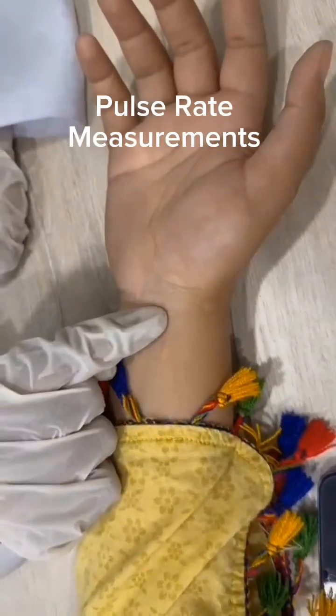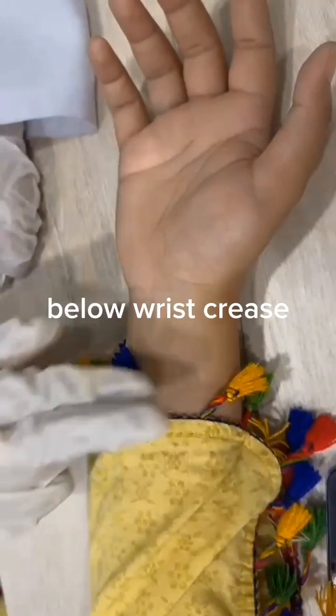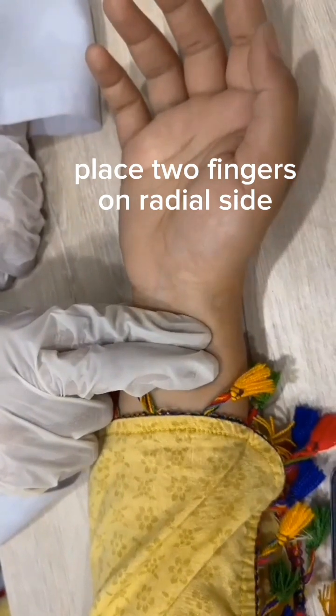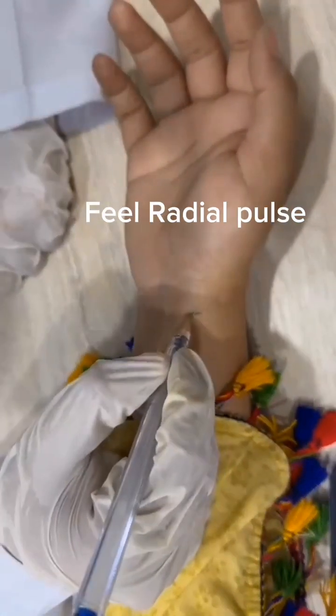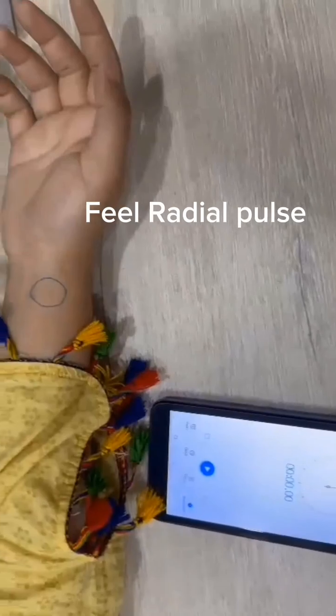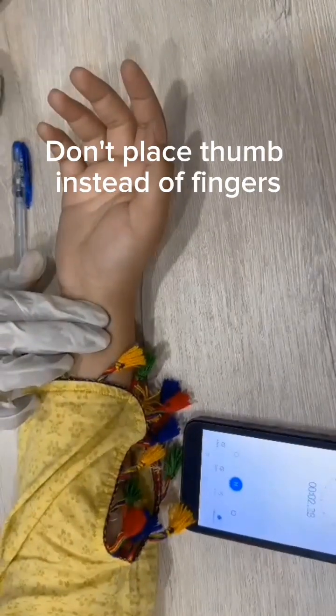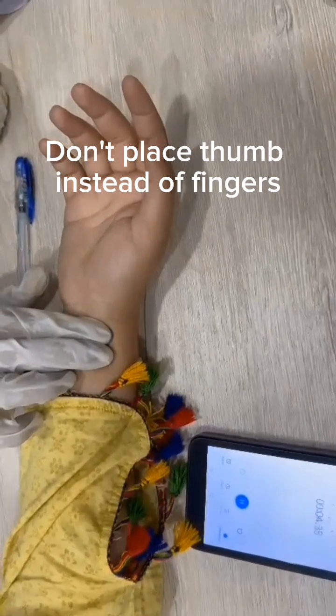Today I will discuss how to measure pulse rate. Place two fingers below the wrist crease and palpate the radial artery. Do not use your thumb. Use a stopwatch to count the seconds. Place the finger on the radial pulse. The radial pulse is placed near the skin surface.